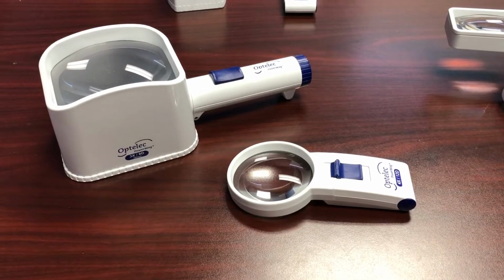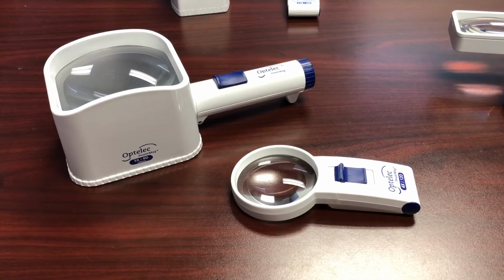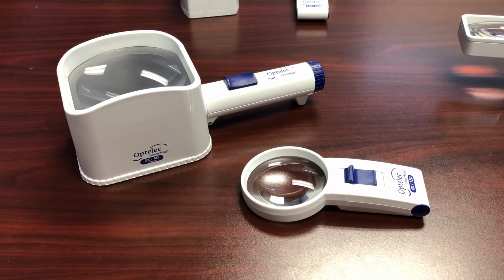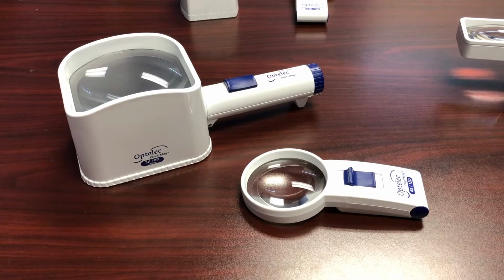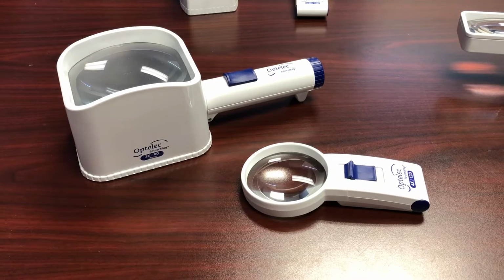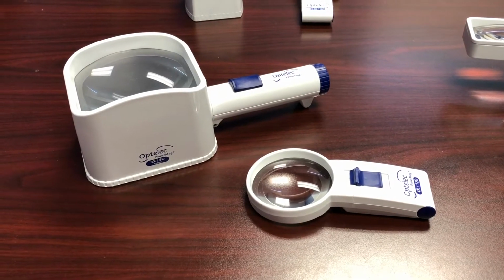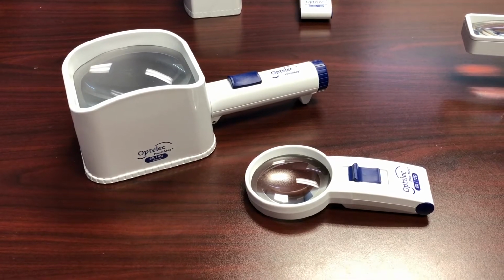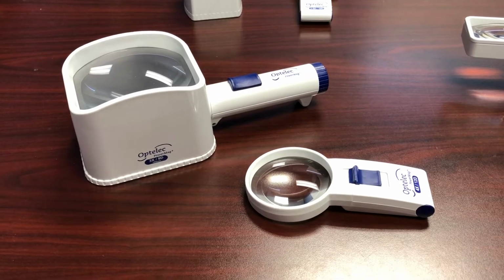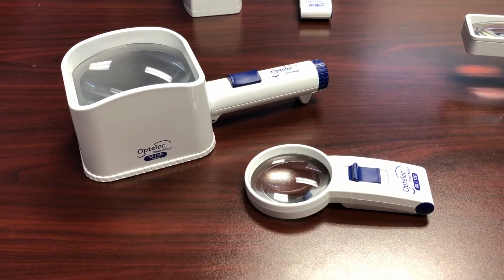The advantage of a stand magnifier over a handheld magnifier is that the focal distance is already set, and the magnifier simply needs to be set on top of an item to have it focus properly. A handheld magnifier needs to be adjusted, the focal distance between it and the target that you're looking at, to be able to find the correct focal distance. If you had tremors or difficulty holding your hand steady, a stand magnifier would be optimal over a hand magnifier. However, portability allows a handheld magnifier to go lots of different places and take up a lot less space.